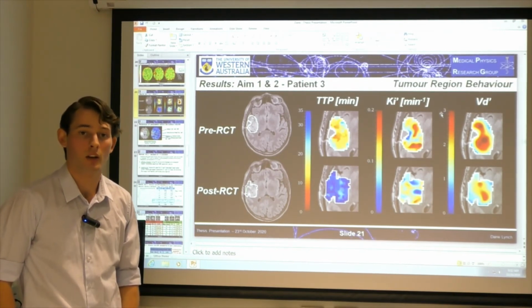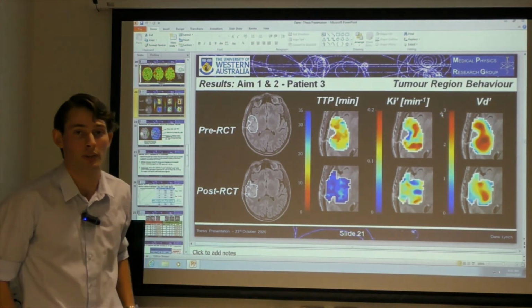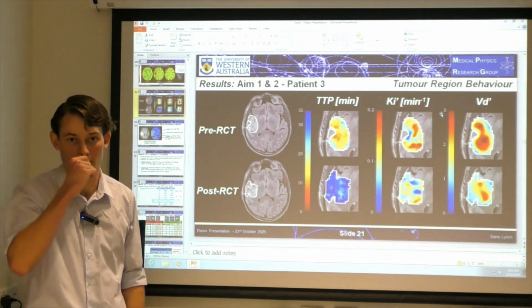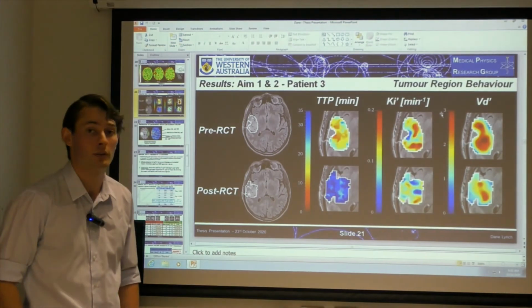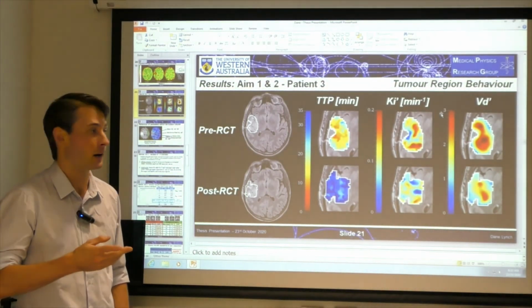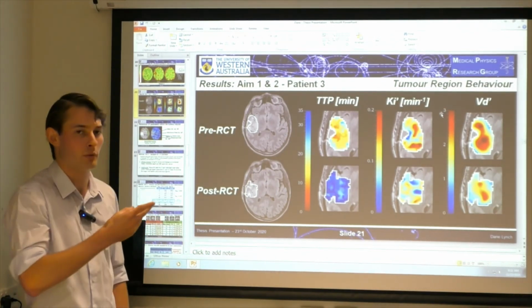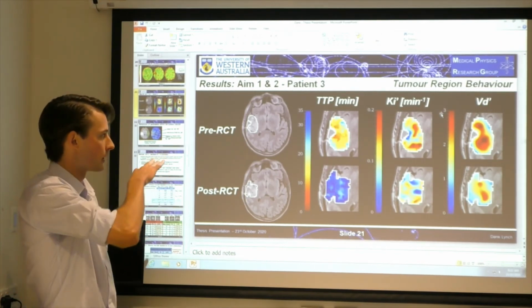So all of these tumour regions, or these tumour contours, were done by Rowshanfarzad, a nuclear medicine specialist at Charlie's. From what I believe, she created these contours using semi-automated segmentation, using tumour to background ratio and using segmentation to create these regions.